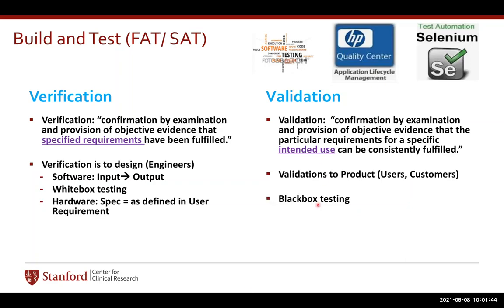And then I was mentioning the testing. So when you do the validation testing, in a GXP system, we do black box testing. What it means is that the code that has been written, we don't see it. We just test it manually to see whether particular things are happening or not. Basically what we see with the eye for a particular thing to happen.